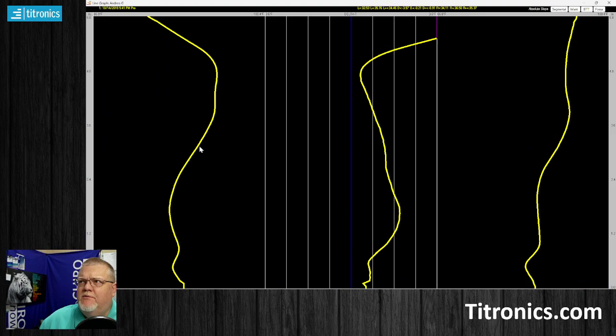You have the direct temperatures, which is the actual temperature from the scanner with left and right, and then you have the delta T, or the difference between left and right. When you have a delta T at 0, that means left and right are exactly the same temperature down to 1/10 of a degree. Anything to the right means the right is hotter. Anything to the left means the left is hotter. So on this scan, nothing was hotter on the left than it was on the right.